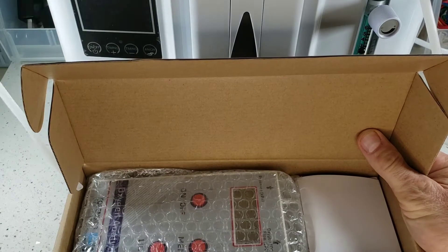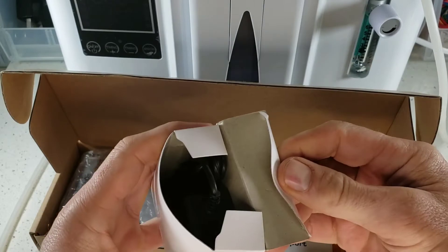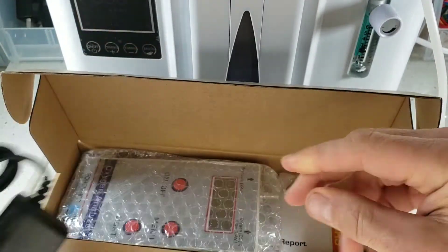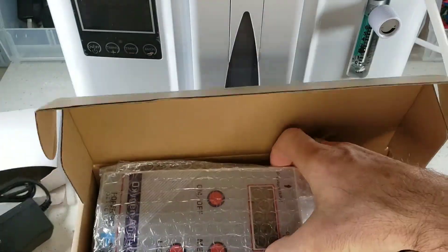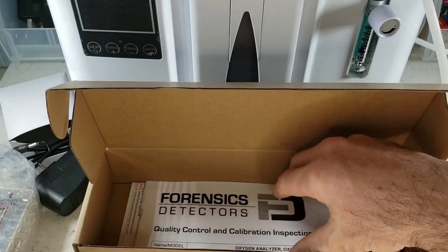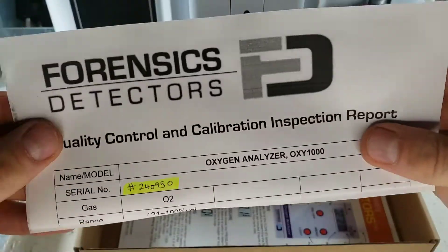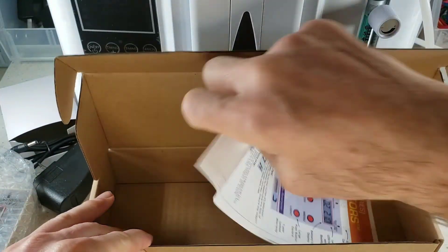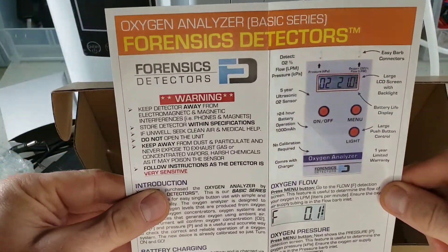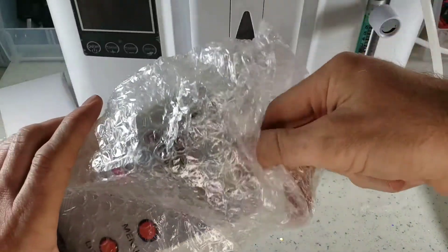Inside you will find a tube that allows you to plug up to your machine. You will find a power adapter that simply plugs up to the analyzer. And of course we have the analyzer itself, nicely bubble wrapped. Inside we also have our calibration certificate signed here in Los Angeles, and our manual — a user guide that can also be found on our website if you ever lose it. Let's put all this aside and take out the analyzer.